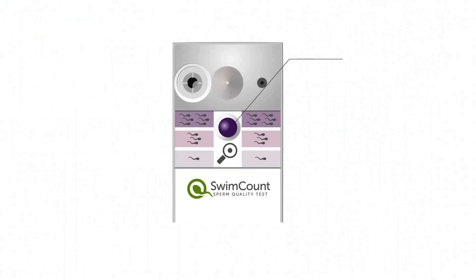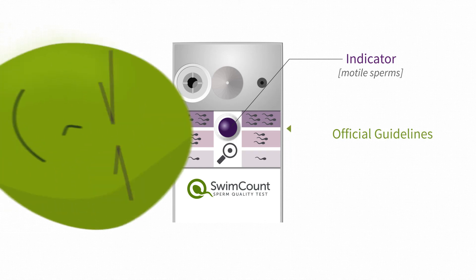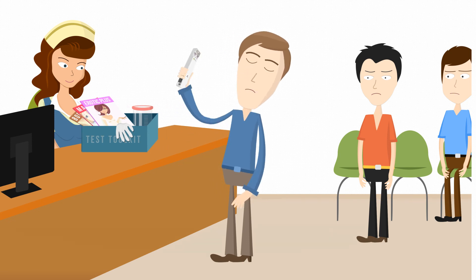The result is easy to read. A blue dot indicates whether the number of swimming sperm cells, called motile sperm, are below or above the official guidelines for sperm quality as set by the World Health Organization. So enough of the embarrassment of taking the test at a fertility clinic — order one and take the test in the comfort of your own home.